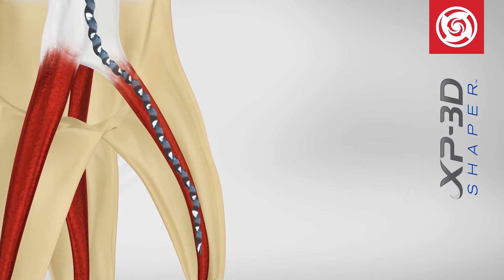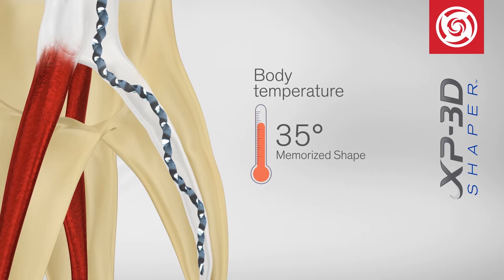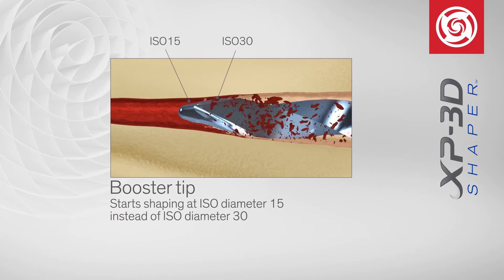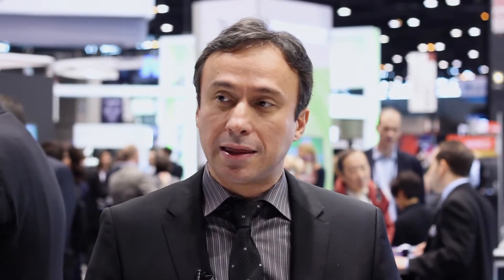The new instrumentation system now released by Brassler USA is the XP3D file, or instrument, that contains a shaper and a finisher. This technology takes advantage of a new NITI wire technology where the wire shape-shifts and transforms from a martensitic phase to an austenitic phase at body temperature. This allows the same file to expand from a specific shape at room temperature to a much larger shape at body temperature.